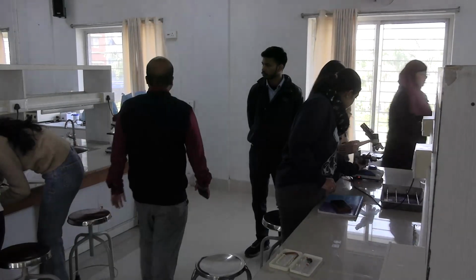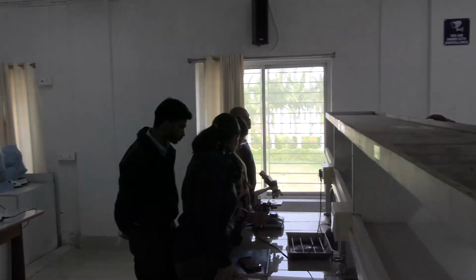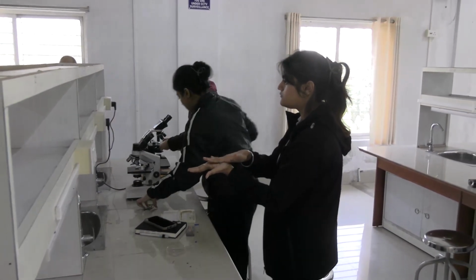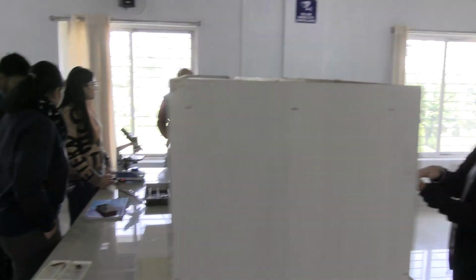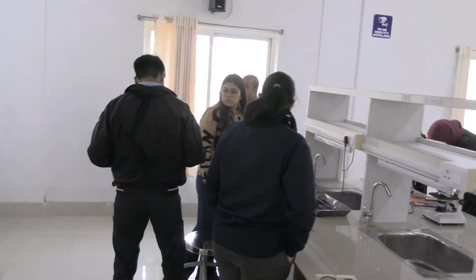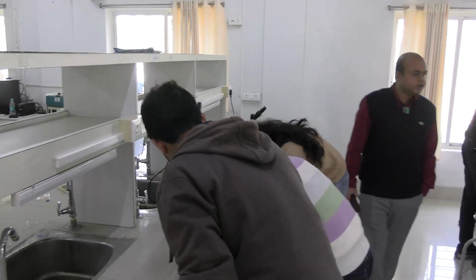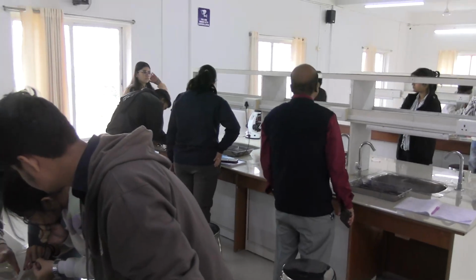So first focus where you have to count, maybe the left upper square. First you will be counting the left upper square, so make the focus ready. You will just remove the chamber, charge the blood and then put it back, so that finding the cells becomes easier after the blood has been charged. So first focus the left upper square. Where will you start? Left upper of the RBC squares, the medium-sized RBC squares.